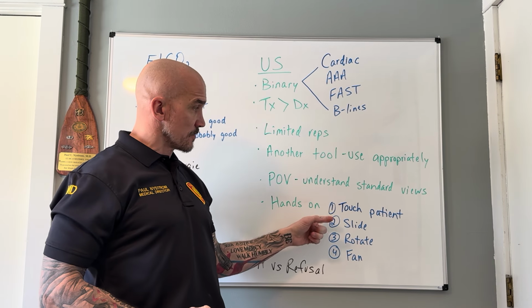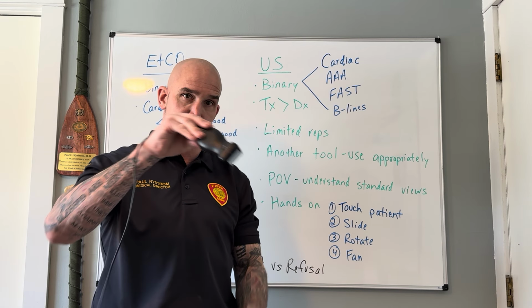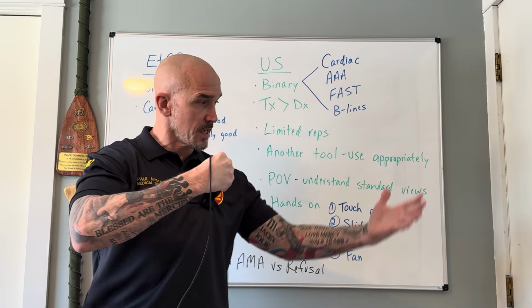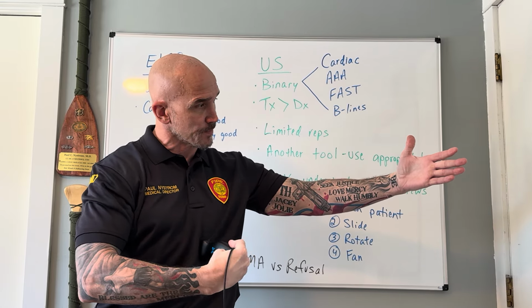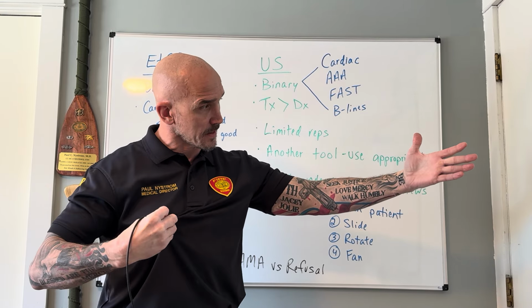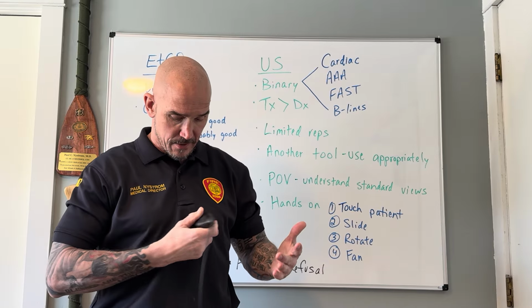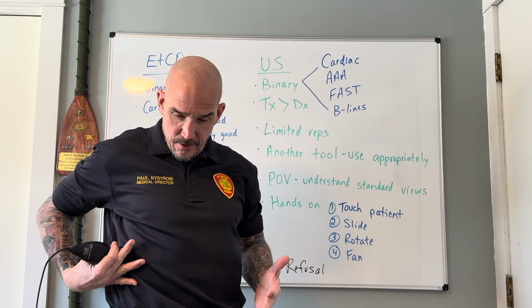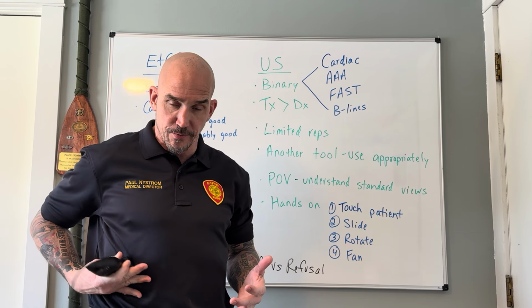Last couple things about ultrasound. Touch the patient. When you have ultrasound gel on, your hand tends to slide. So if I'm hanging on the back of the probe here, just touching a patient, and I'm looking at the monitor over here, trying to find a cardiac view or whatever I'm looking for, I'm probably going to be sliding way around here and realize why I can't get my view, and then look back at the patient and I'm way off here, right? So anchor your hand to the patient, whatever side you're looking at, have your hand on the patient so you realize where the probe is going.